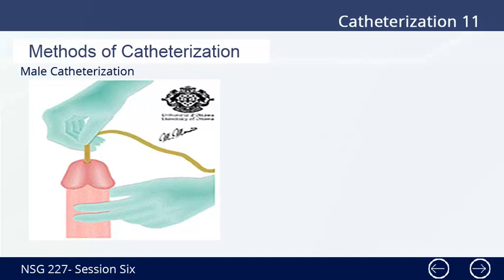3. Drape the client's upper body with a bed blanket and cover the lower body with the bed sheet so that only the genital area is exposed. Straightens the urethra and allows for ease of insertion. 4. Follow actions 7 to 15 for female catheterization. This provides easy handling and ensures that the balloon is in the bladder. Not forcing also prevents irritation or trauma to urethral mucosa.